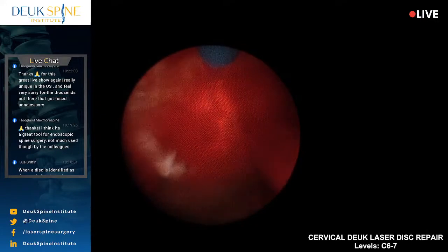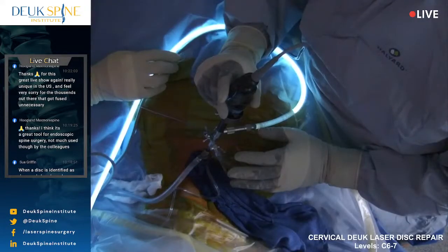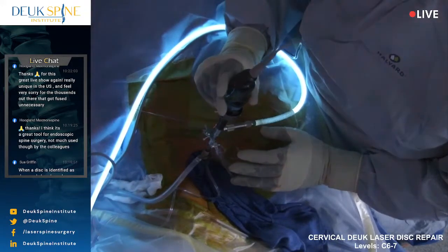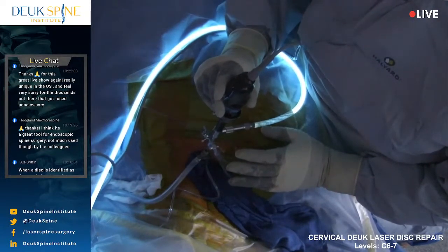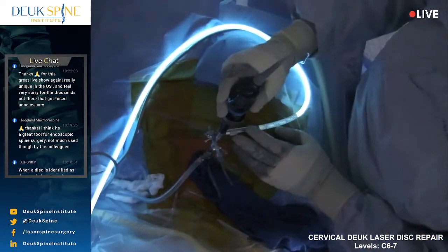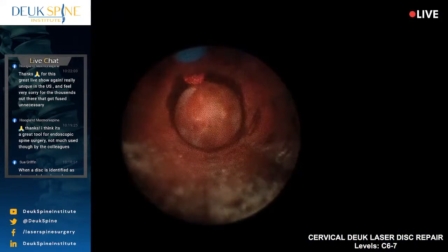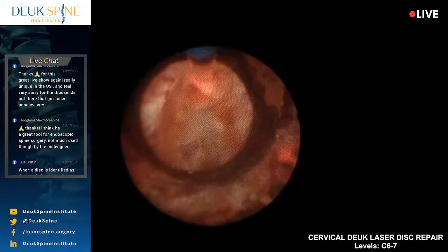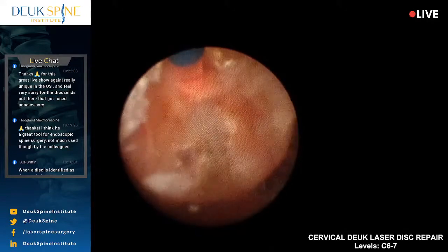There's not enough. So you can always see the bleeding, and I call them fumaroles, because if you know what a fumarole is on the bottom of the ocean, it's like a thermal vent. But look what happens when you get good, proper irrigation. You don't see them. And that's what I want, proper irrigation. Makes a difference.